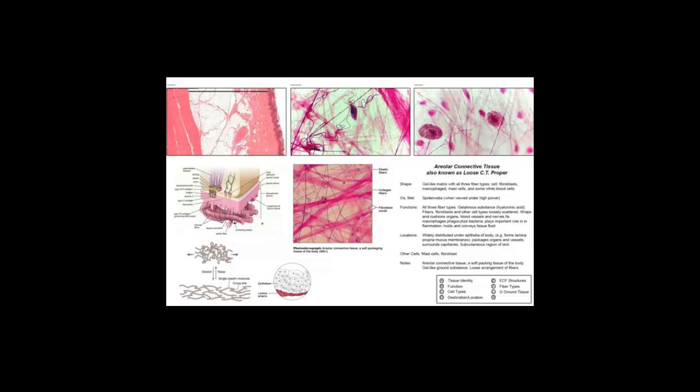We'd move through the dermis, the thickest layer of the skin, into the hypodermis here. We see a number of large blood vessels. There's an artery, there's a large vein, and the adipose connective tissue that makes that structure, the hypodermis or subcutaneous layer, and skeletal muscle just beneath that as we move in towards the skeletal muscle's attachment to bone. This is a great picture showing the same sequence of cells and tissues as we move inward, and the bundles of muscle that would be present in that slide.